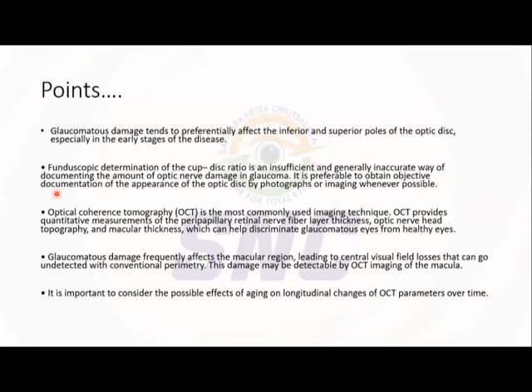So whenever you are documenting, like you have to write case sheets also, and case presentations, you have to mention clinical examination of the disc. Very important. There will be some 7 to 8 parameters by which you have to write. So you have to mention the shape of the disc. You need not mention size. It is the shape of the disc which is important.